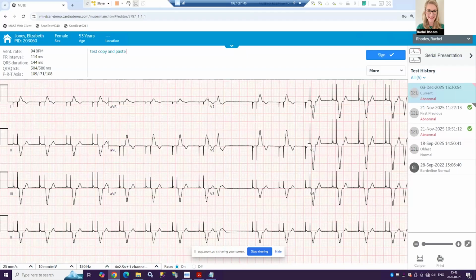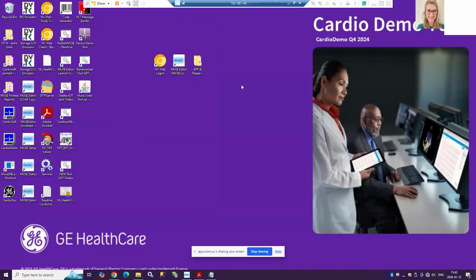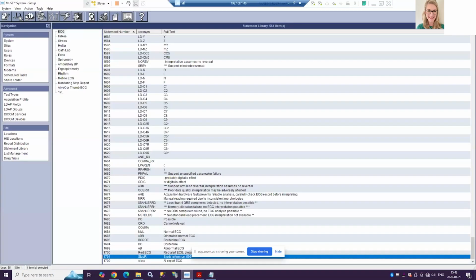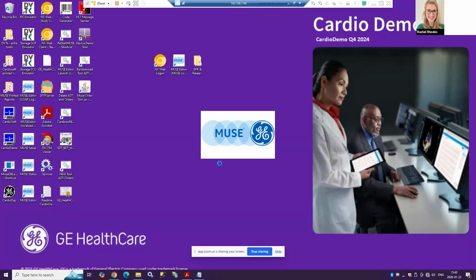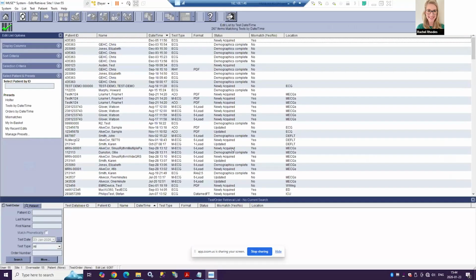But we do have a little bit of time, so I am happy to go into the editor client unless we've got loads and loads of questions. I can always run through a little bit of it now. There are no additional questions, and we do have 15 minutes more of the meeting. So if you would like to show it, that's perfectly fine for us. Absolutely. So there are quite a few different ways you can do it, and it's going to be slightly variable depending on how much data you want to export.